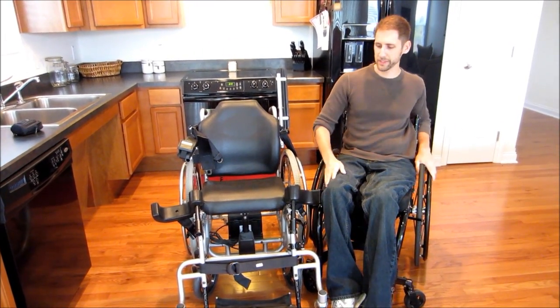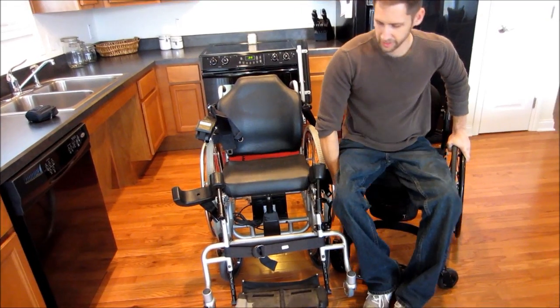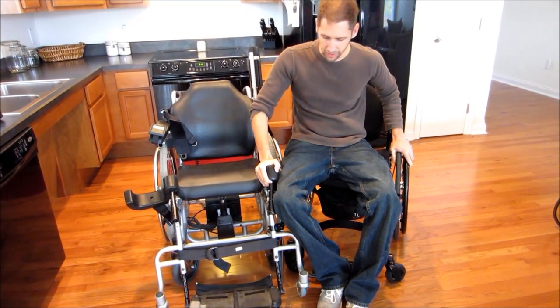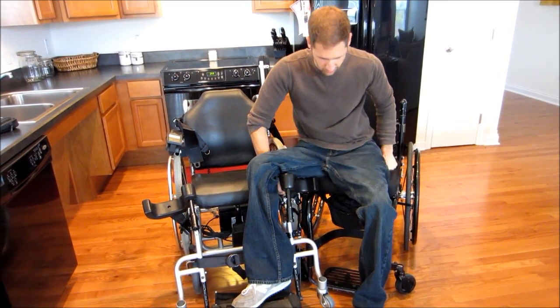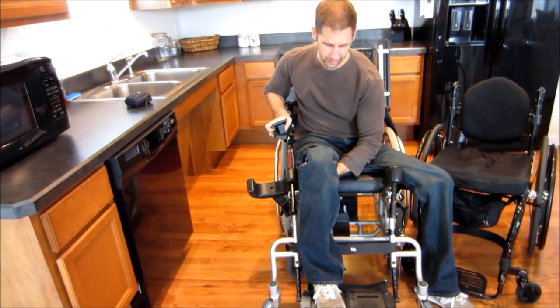The hardest part about this chair, it seems like they made this chair for somebody who could actually stand up, which obviously doesn't make any sense. This foot plate usually flips up for somebody who wants to sit down, and it just doesn't make a whole lot of sense. The hardest part is to clear this. So I usually put one leg over that, and then I'll just kind of lift over, get my legs positioned.